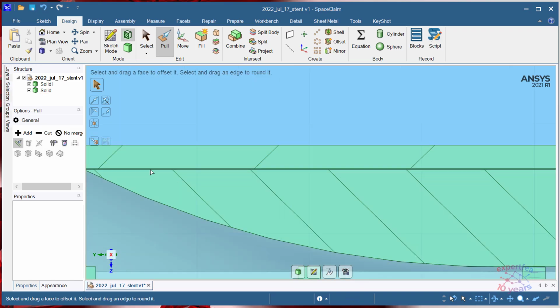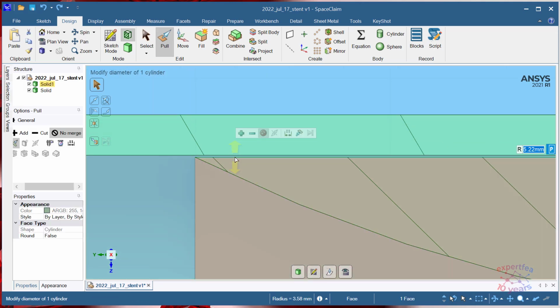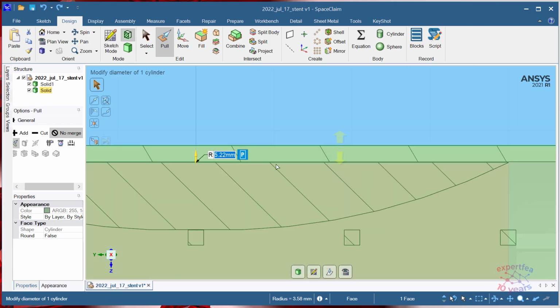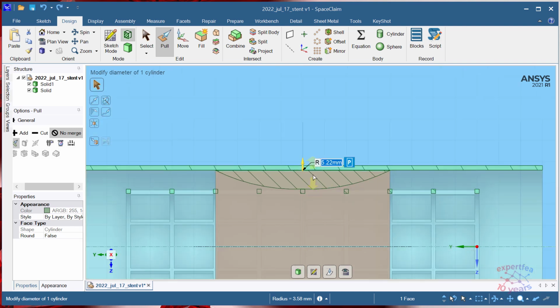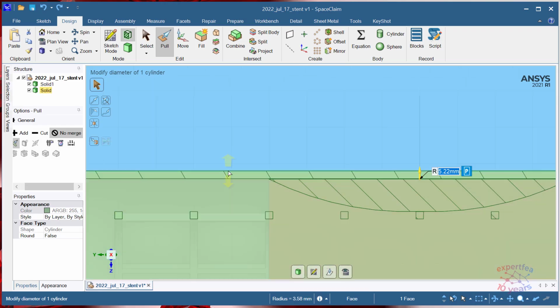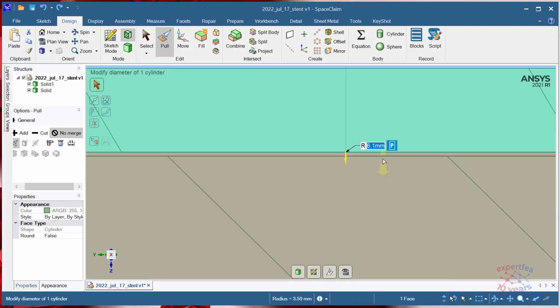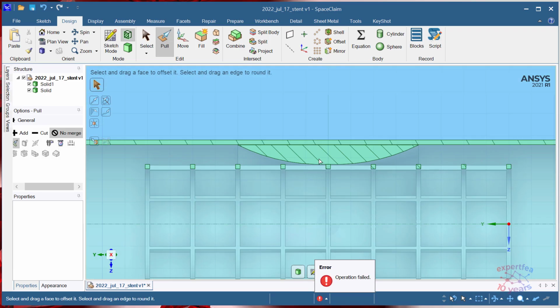Let's say I'd like this to be even smaller. Let's see if we can. So if I select this edge, it will be the outer edge of the plaque. Instead of 5.31, I'll write 5.32. Let's see what. Because I forgot to hit no merge here. Yeah, so at this moment this software does not think very well. Let's decrease the thickness. Instead of 6.1, can we do, I don't know, 6.08? Can I? No, of course I can't. Why should it be possible?